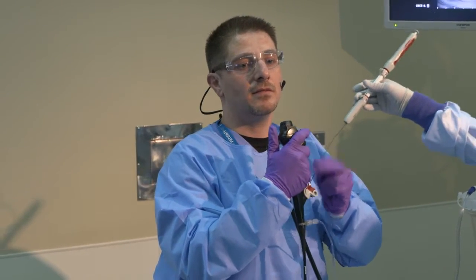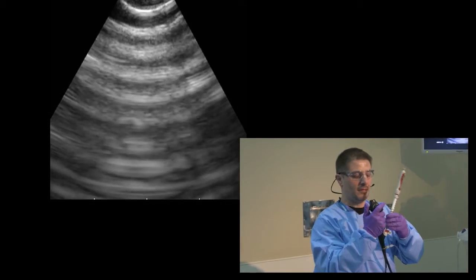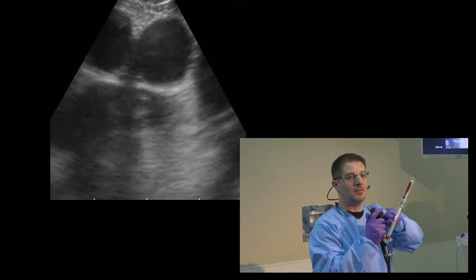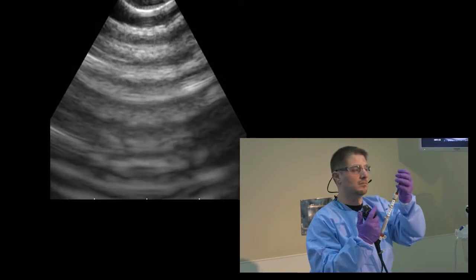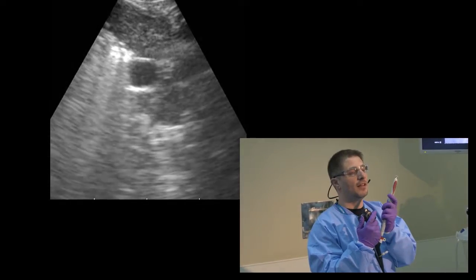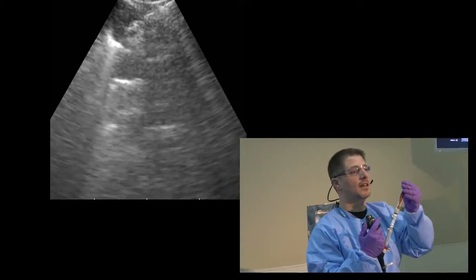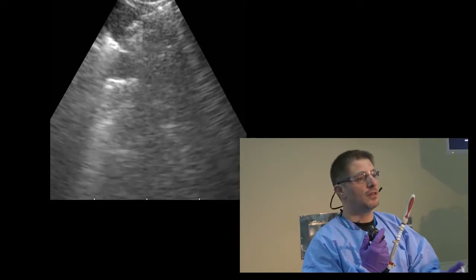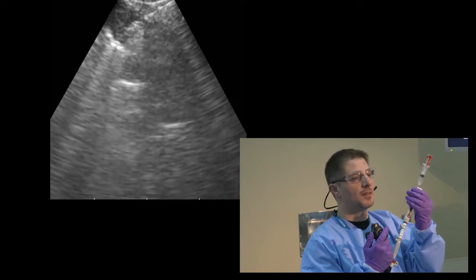Now we're performing the pass for cell block. The sheath is good. You identify your lymph node again, and then you push the needle inside it. We'll take this time this whole stylet out, and we'll apply suction to achieve endobronchial ultrasound with transbronchial needle aspiration.